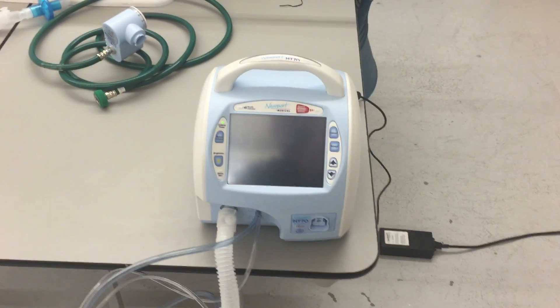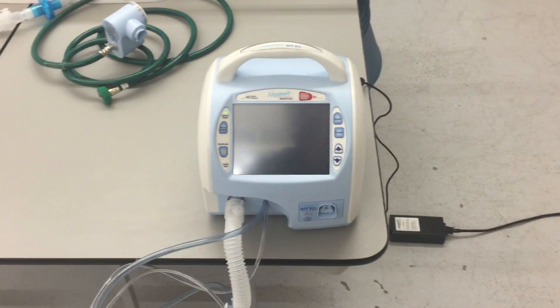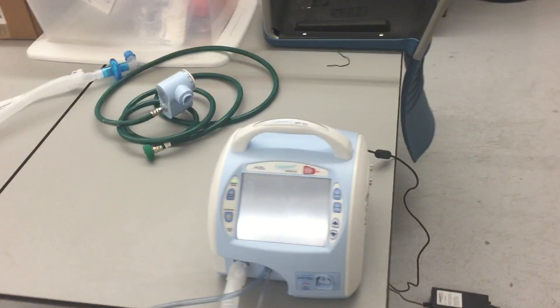Good day, everybody. This is Chris, back again with the Ancient Scholar, and now we're going to go ahead and do a basic ventilator setup. So I have the ventilator plugged in, I have the tubing on, and I have my test lung ready.